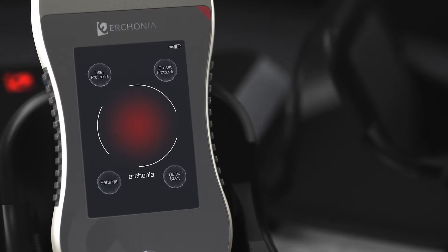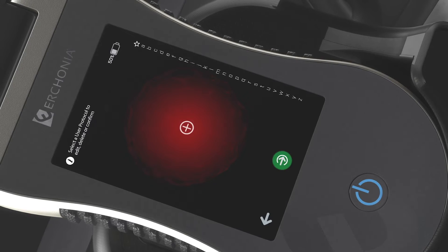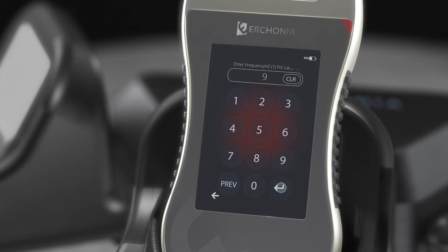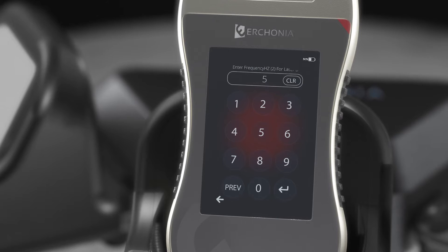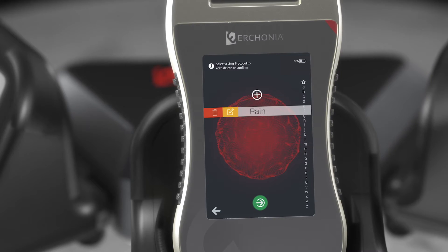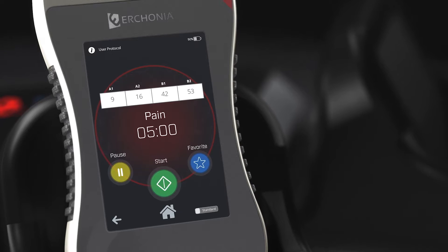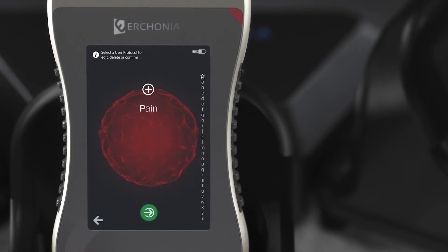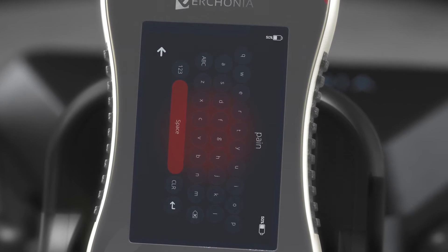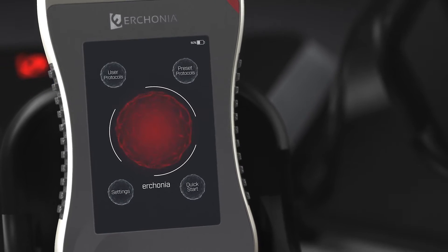Next we'll look at User Protocols mode, where you can enter and save protocols to your device. Press the plus button and name your protocol — for example, 'Pain.' Enter your frequencies: 9, 16, 42, and 53, with a treatment time of five minutes. It is now saved. To use it, click on it and press the green button, then Start to begin treatment. You can also favorite protocols by pressing the favorite button and access them via the star icon. To edit, click a protocol and press the orange Edit button. To delete, click a protocol and press Delete. To power down the device, hold the power button and select Power Down.